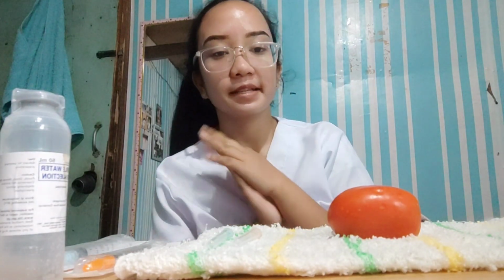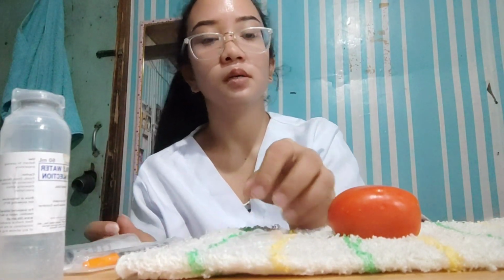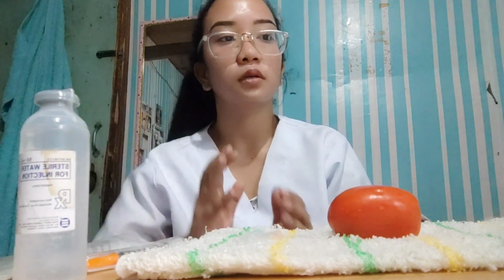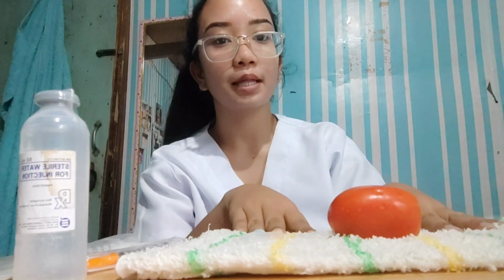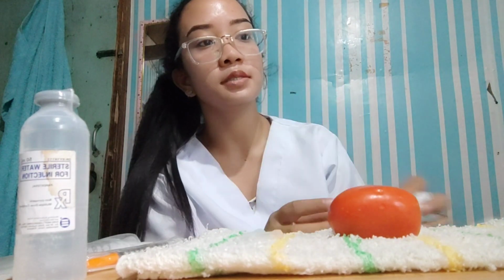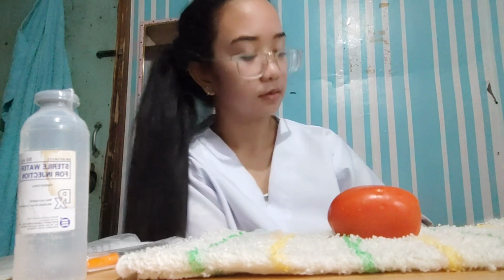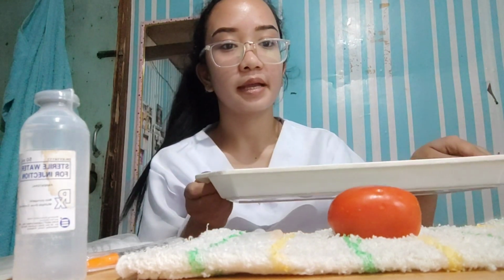So the equipment that I will be using is sterile syringe, needles, and ampules or vials, and sterile towel, and forceps, and cotton balls, and alcohol, and injection tray.